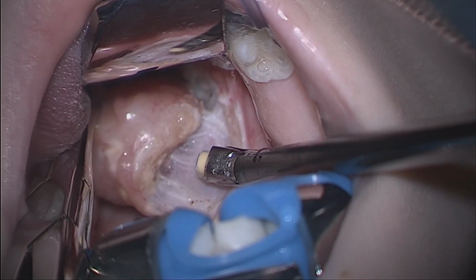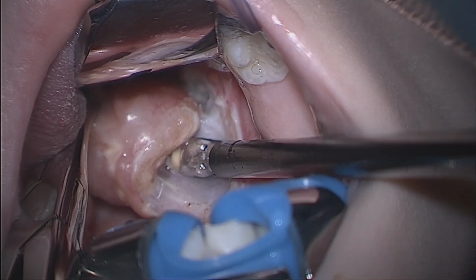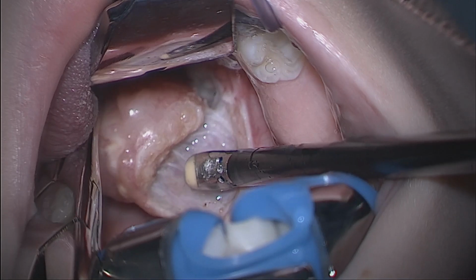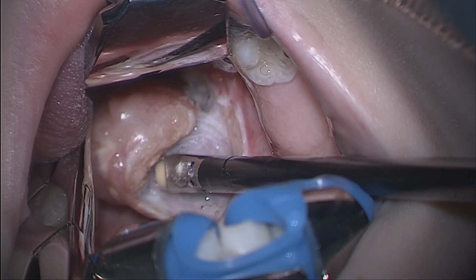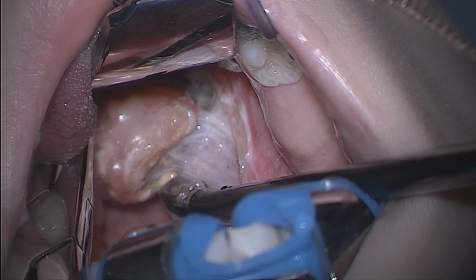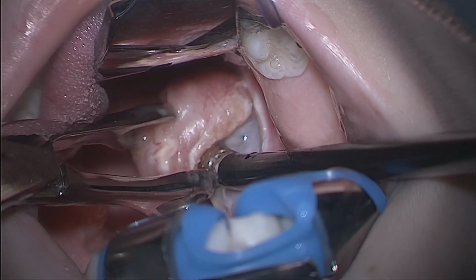It's important to remain within the correct plane in order to allow the tonsil to be dissected with minimal effort. Sometimes, however, the plane may be obliterated by scar tissue from previous recurrent tonsillitis or previous peritonsillar abscesses.